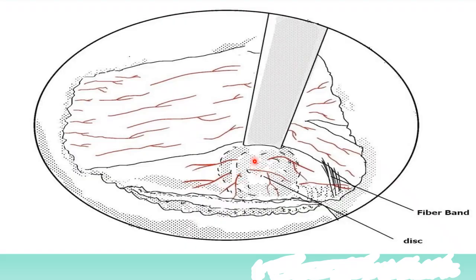Then after the disc space is cauterized, it is known as annuloplasty.